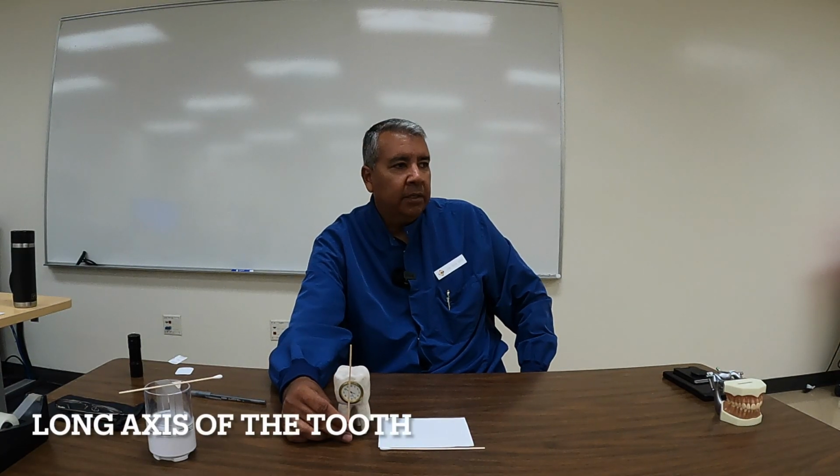What are those two angles? The two angles that we're cutting are the angle of the film and the angle of the tooth. The angle of this tooth is going straight up and down, right? I'm going to give you a new name for this angle of the tooth. The angle of the tooth is from the crown through the root. It is that general angle of that particular tooth. That is called the long axis of the tooth.